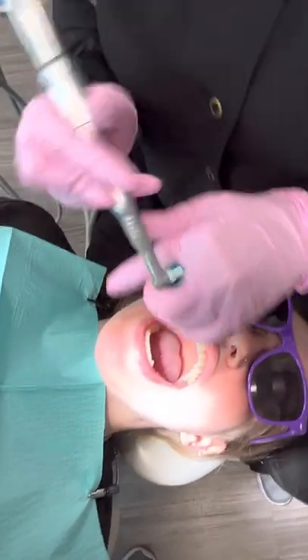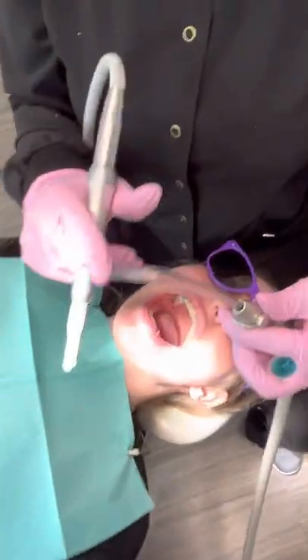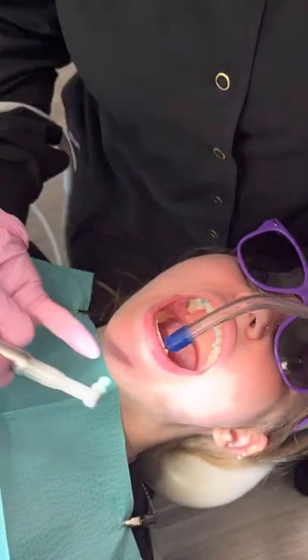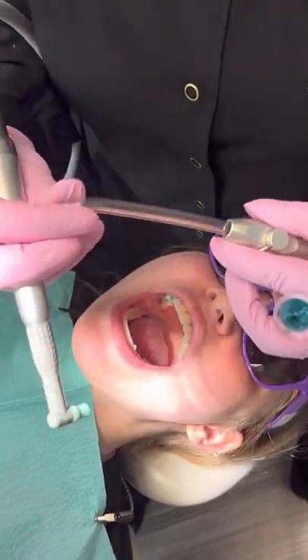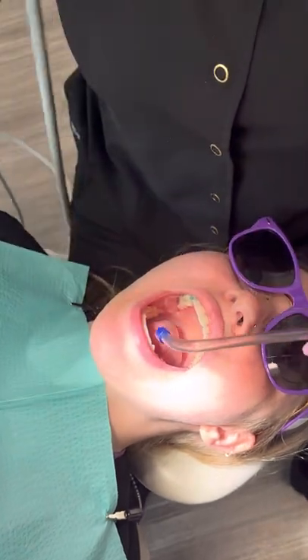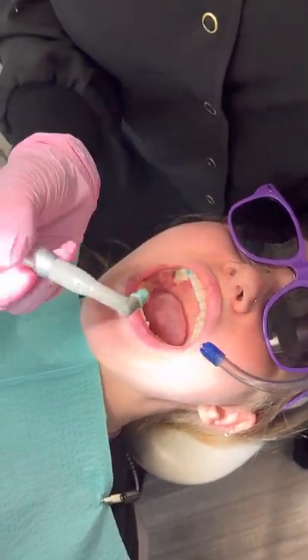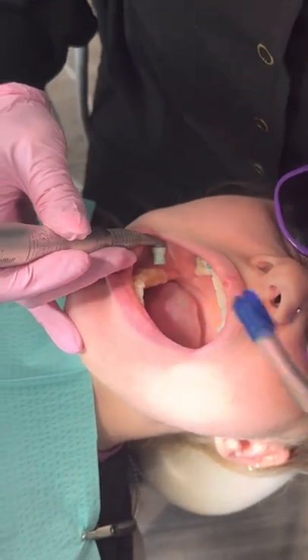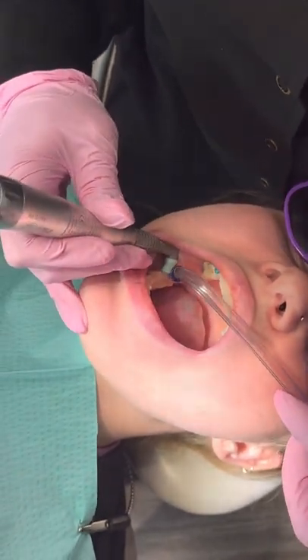Now I'm going to go ahead and grab my suction. This will be my tool as I brush the bottom teeth. The reason I use this to retract the cheek is because the saliva glands are down here and you're much more likely to get a big flow of saliva when brushing. Taking this and again utilizing the fact that it spins, I'm going to pull and retract the cheek.